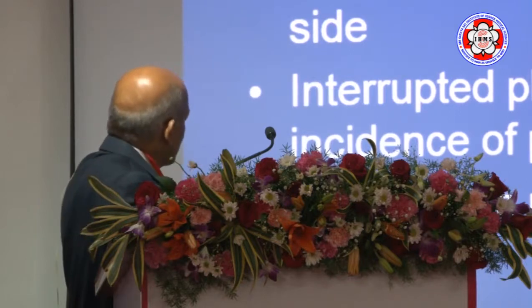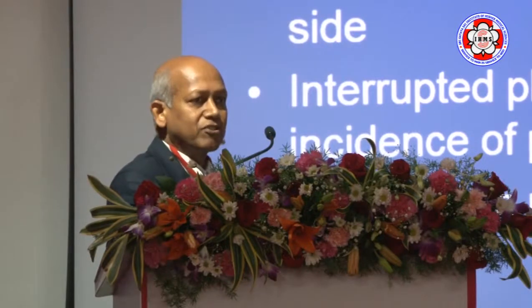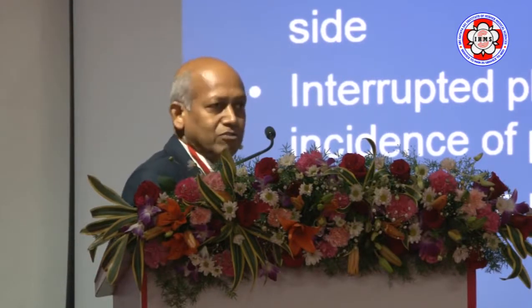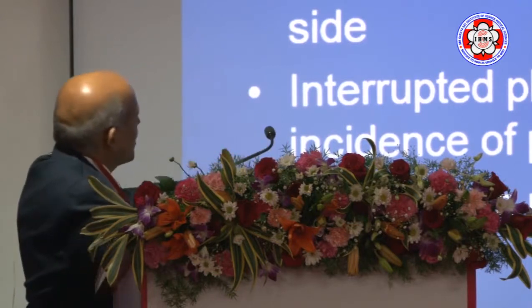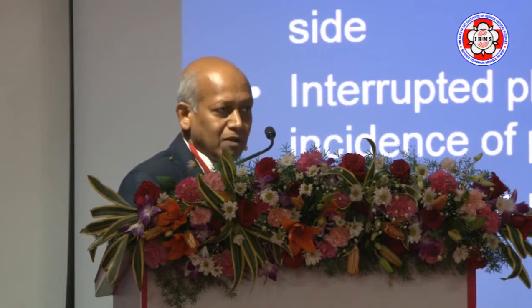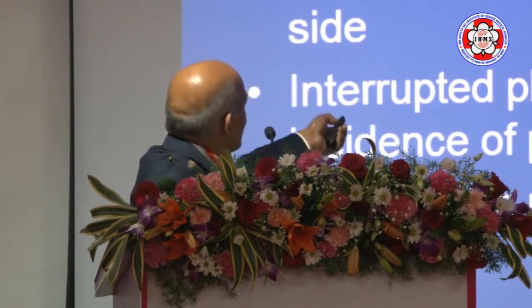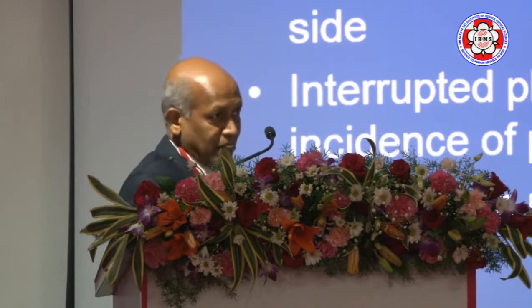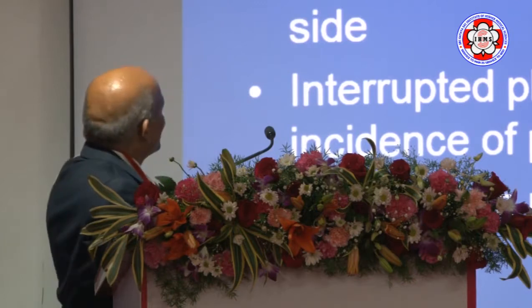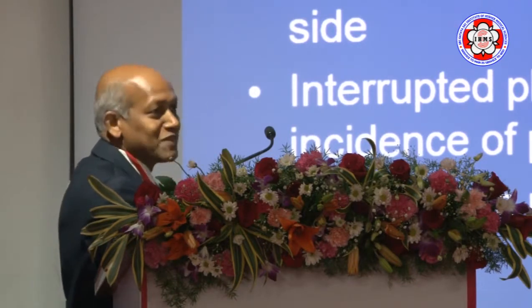In the non-everting technique, the valve sits supra-annularly, above the annulus. There's no tension, there's no eversion. So if you have a calcified mitral annulus and you're trying to put in everting sutures, there's a good chance you're going to have a tear in the annulus. In my practice, till today, I've not done everting sutures. That's how I was trained. But when I came here, 90% of valves are done the everting way. So I've learned something here, and also taught something to these people here.